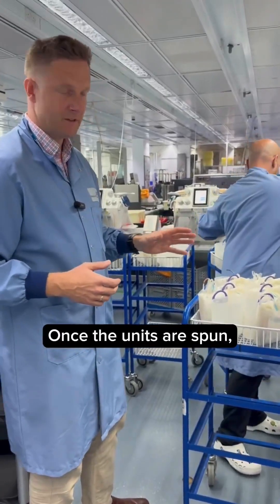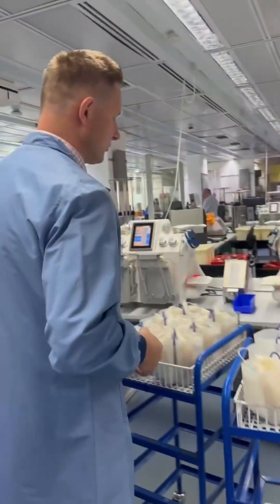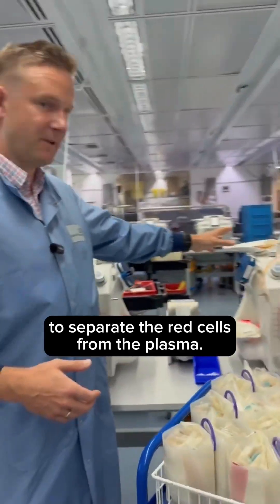Once the units are spun, they can then be taken onto the presses and they are pressed to separate the red cells from the plasma.